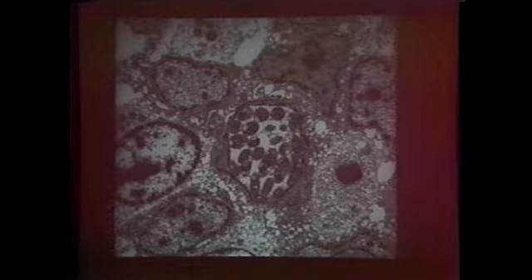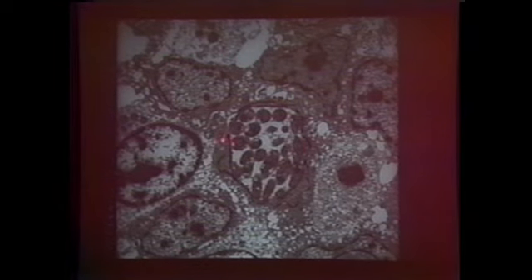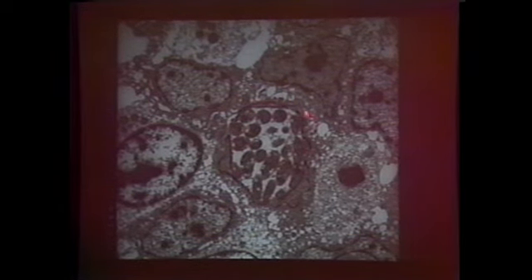So what do you think it is? A coccidian, right. We did EM on it. Look, here's the host cell nucleus, and you see all these zoites from a schizont. Hey, isn't this pretty? You see, and there's different schizonts. They're at different stages of development. This is mature, this is not. Here we go. Look at how they're budding from a residuum.